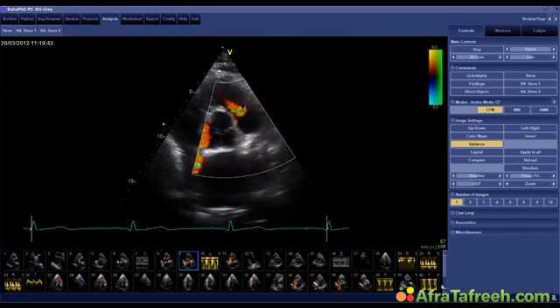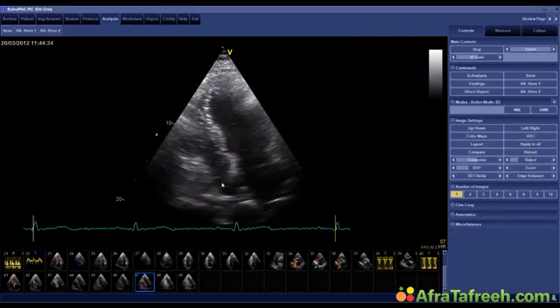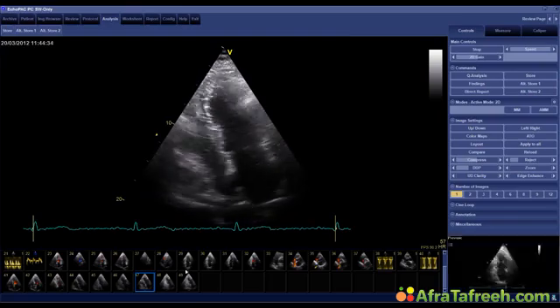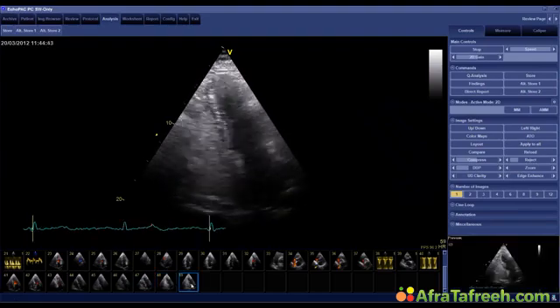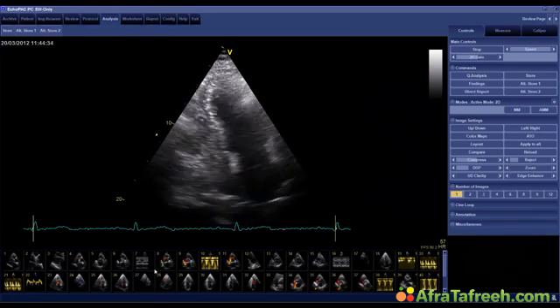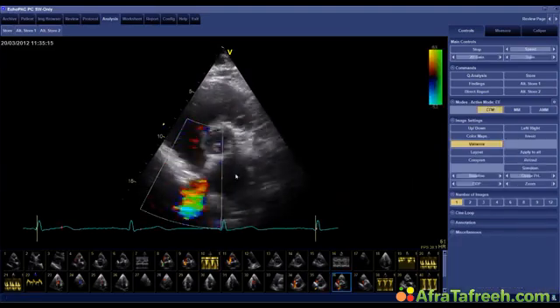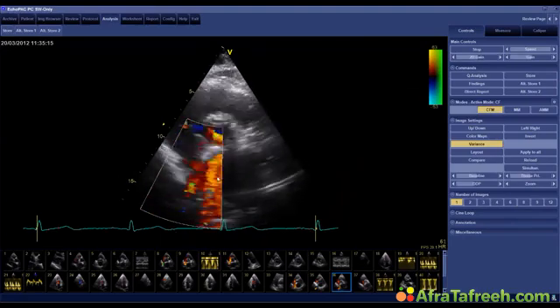But if you really want to be sure, all you have to do is inject some contrast, and this is what we did in this patient. Okay, and surprise, surprise, contrast is coming here into the right atrium, but nothing of the contrast is passing across the atrium into the left atrium. So here we have actually excluded an atrial septal defect. The teaching point I'm trying to make here is don't be fooled by color jets which seem to appear as if they are an atrial septal defect. Always go down to other images which try to document whether it really comes from the interatrial septum or maybe comes from the inferior vena cava.